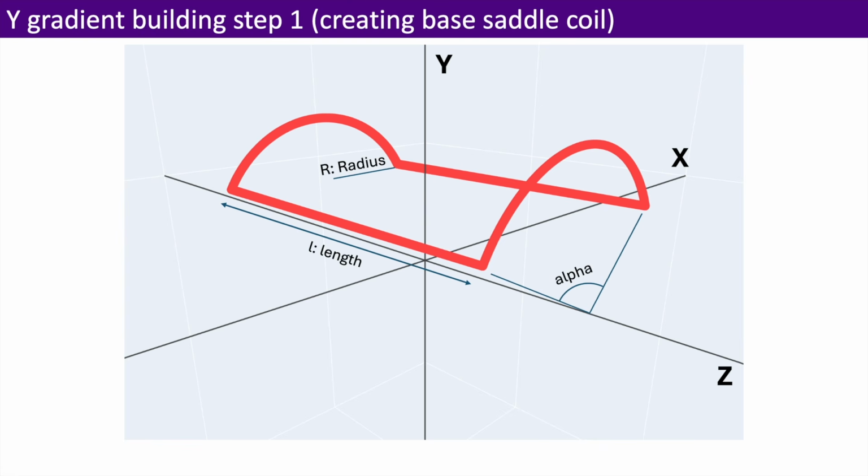which is the angle. The alpha can range from 180 degrees to 0, but 0 is impractical, so let's say like 30 or 40, but usually it's around 120 degrees, with given length, radius, and alpha. It's important to note that the base saddle coil is centered around the origin, but to get the gradient field we need to translate, rotate, and mirror the base gradient coil.